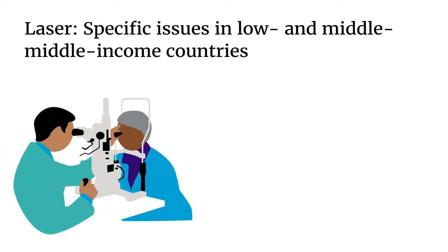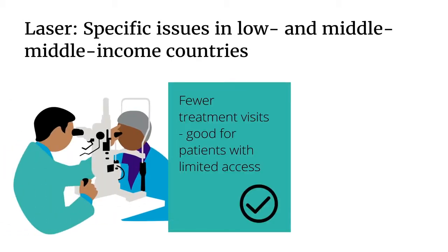There are some specific issues in providing laser treatment in low and middle-income countries. On the positive side, laser treatment means fewer treatment visits are required than for injections. In selected cases, it can be possible to stabilize the situation with one treatment. This is important for patients in remote settings with limited access to eye services. Excellent outcomes are possible in early maculopathy.